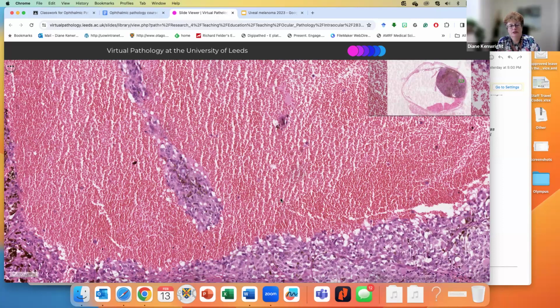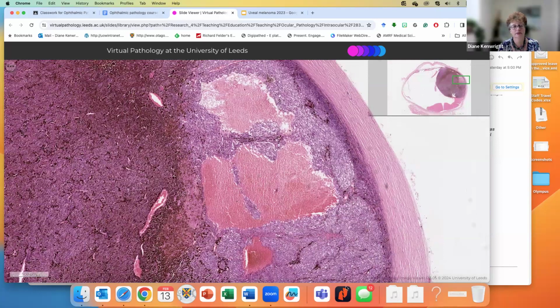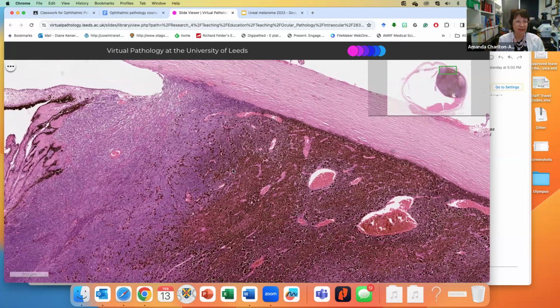Whereas if it's necrosis, it's got dead cells. And this looks super fresh, so I think it's come out during the surgical manipulation in order to get it out. These vessels are pretty fragile and leak. You've busted up some of those vascular loop networks and they've bled into the tumour because they're very capillary sized. I don't see hemosiderin either.